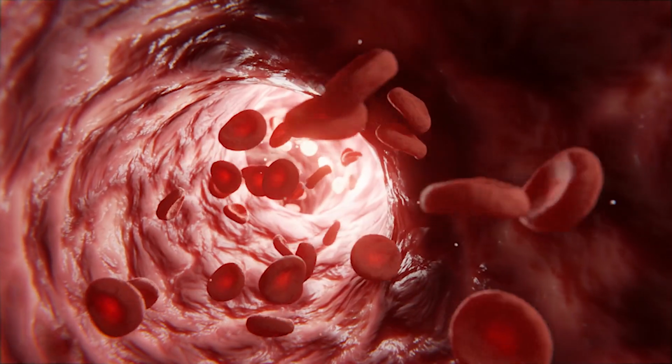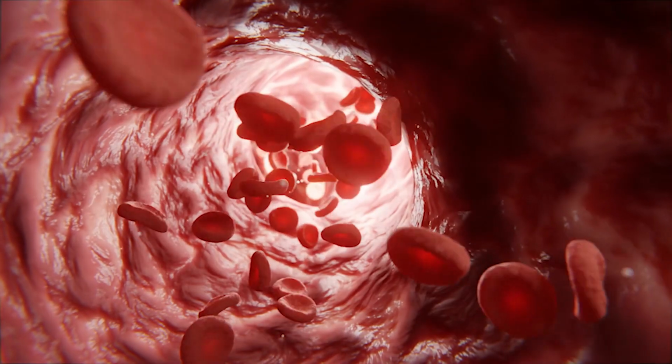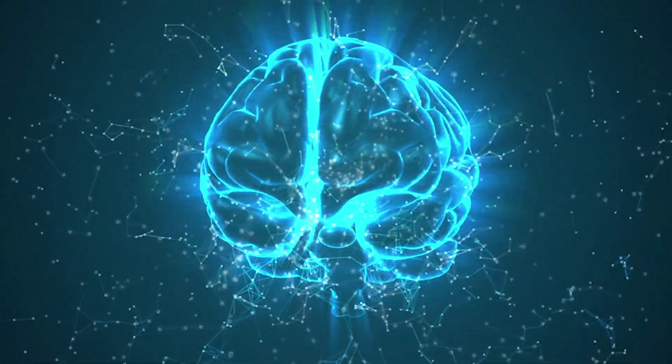But human blood actually has iron in it, and whenever blood flows, it takes the iron with it and distorts the magnetic field and affects the MRI signal. That's how fMRI is really generated. So while we are taking images of the brain, let's say the patient is lying down inside the scanner, and for 10-20 minutes they're being imaged, during that entire time different brain regions get activated.